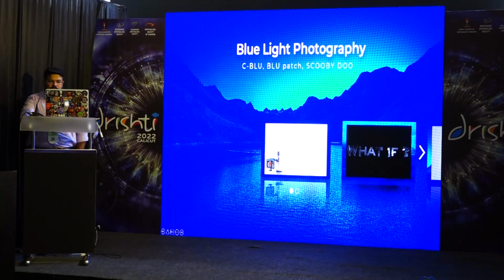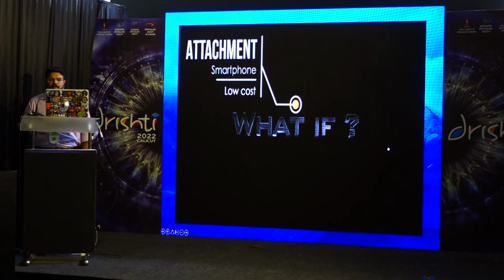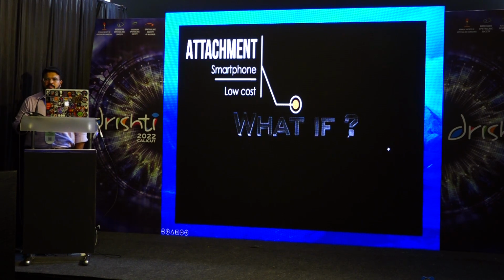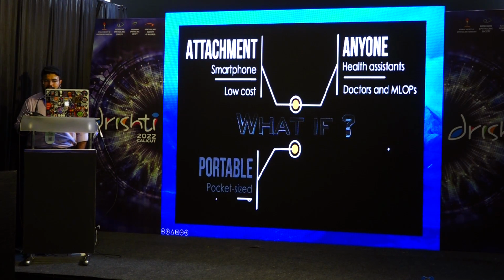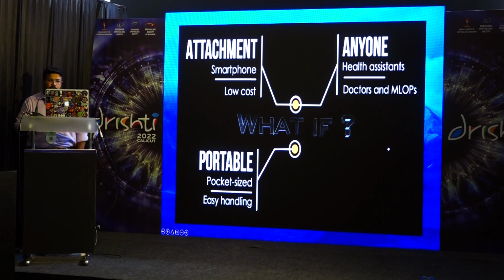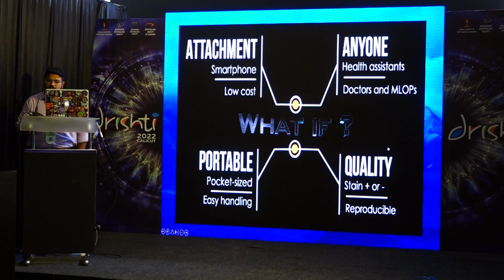So we thought to ourselves, what if we can develop an attachment for smartphone? Because everyone has a smartphone nowadays, but it has to be low cost. It should be available and useful to anyone, health assistants, doctors, and MLOPs alike. It should be portable, pocket-sized, and easy in handling. At the same time, it should give good quality images, stain positive or negative, and should be reproducible.